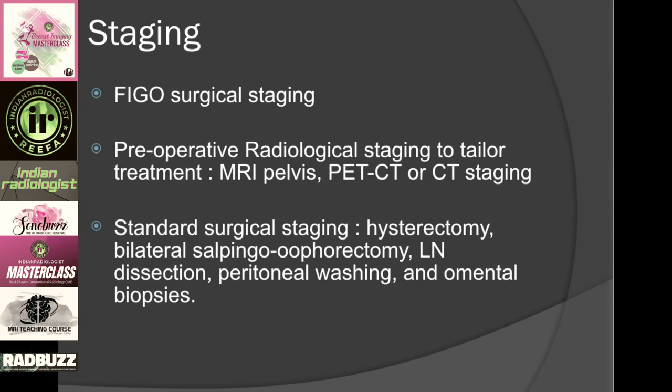Staging is FIGO surgical staging, but as I mentioned, we now have MRI of the pelvis for local staging of the disease and a PET CT scan or just a CT scan for full staging. The standard surgical staging will include hysterectomy, bilateral salpingo-oophorectomy, lymph node dissection, peritoneal washings, and omental biopsies.